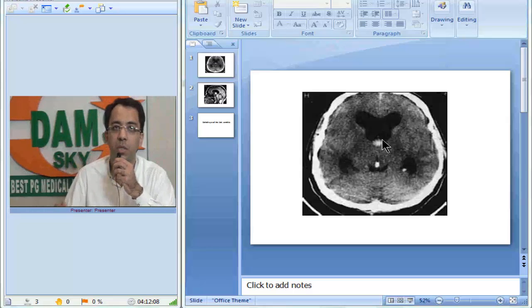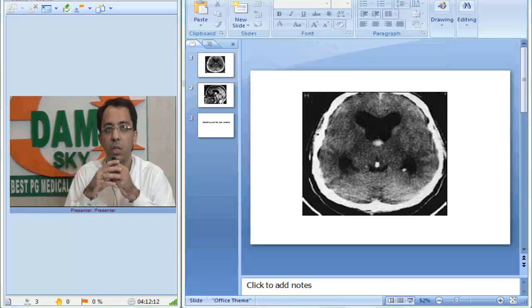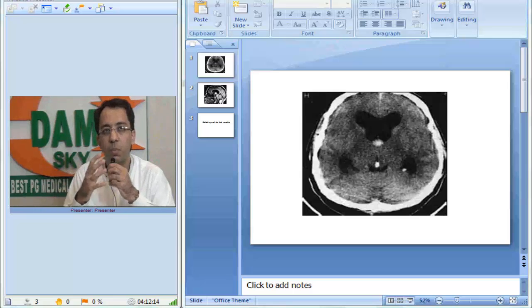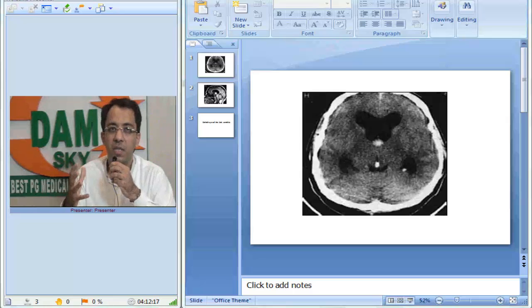This is a colloid cyst. Colloid cyst is hyperdense usually because of proteinaceous content. It is believed to be a remnant of paraphysis.